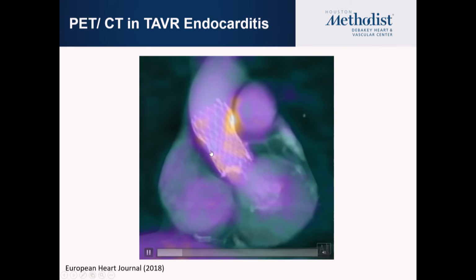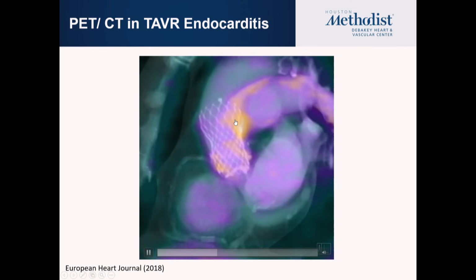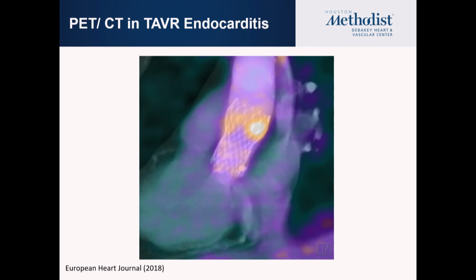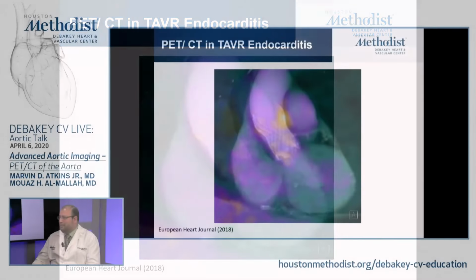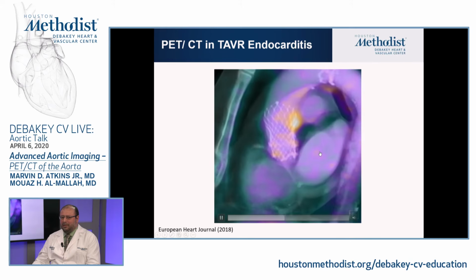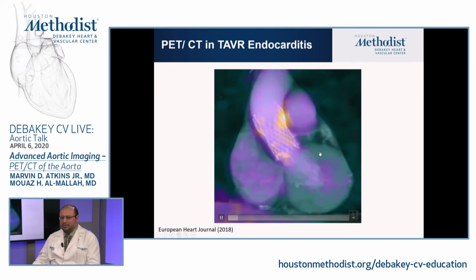Now, obviously, it becomes more complicated in terms of detection if the patient has taken some antibiotics. So now the inflammatory response has weaned off a little bit. Cultures may be negative. So yeah, you may potentially end up with some false negatives.